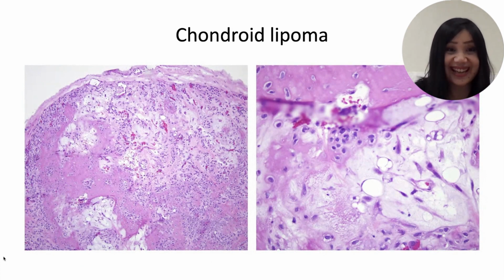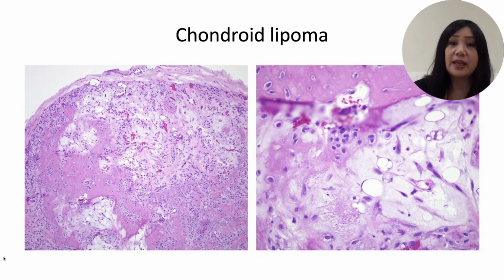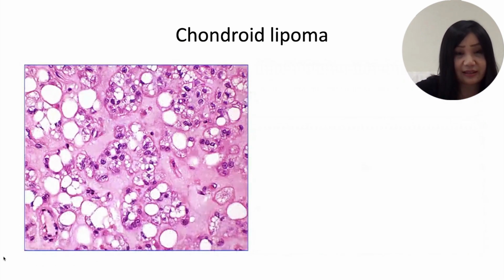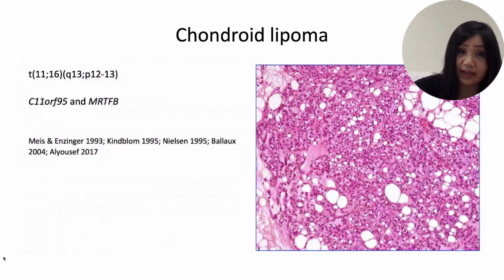And so just very briefly, these are circumscribed neoplasms, and this is a classical picture of a tumor with this very prominent hyaline type or myxohyaline stroma in variable proportions. Sometimes the adipocytic component or the lipoblastic component is very prominent, but here the adipocytes and the lipoblasts are relatively scattered, and we can see on the right these scattered plump adipocytes with non-atypical but plump lipoblasts. And then we can see this very prominent hyaline, eosinophilic stroma, with again very plump lipoblastic component. No atypia as such, not associated with significant mitotic activity or necrosis, and variable sheets of adipocytes.